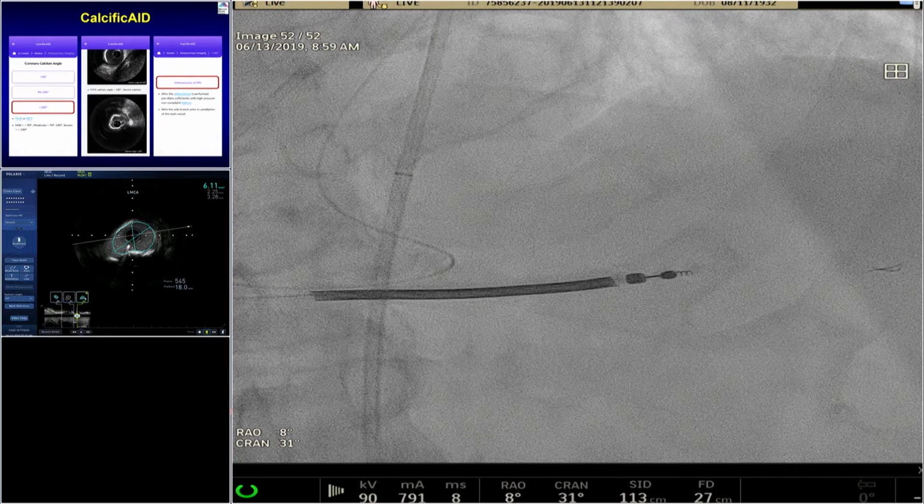Let me show my hands here to show the new Rota Pro device, which does not have the pedal. For those of us who learned Rota in the past, our left leg keeps working, looking for the pedal. But for the newer people learning, Rota Pro is probably a good one, because they don't have to work with the leg and the hands.